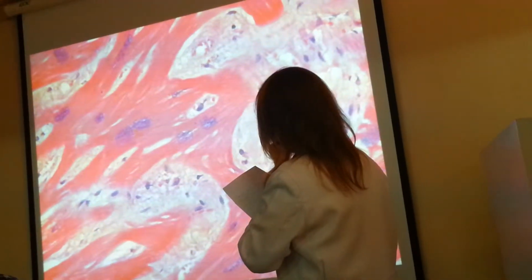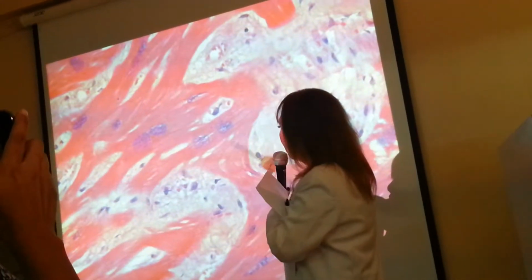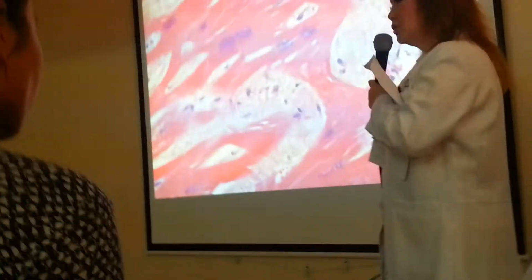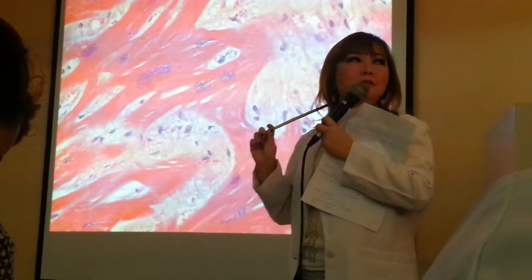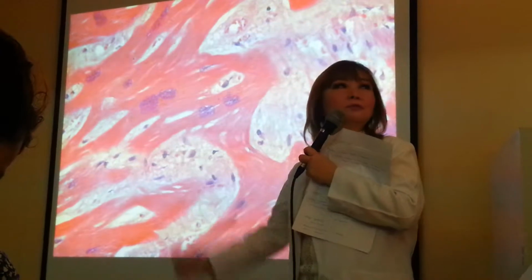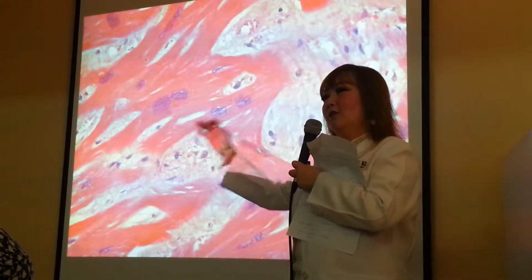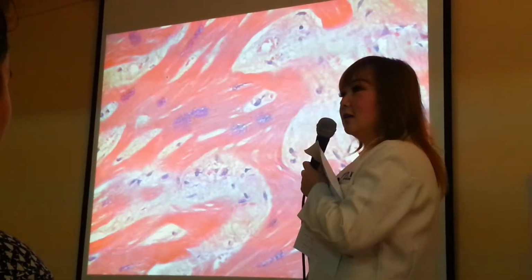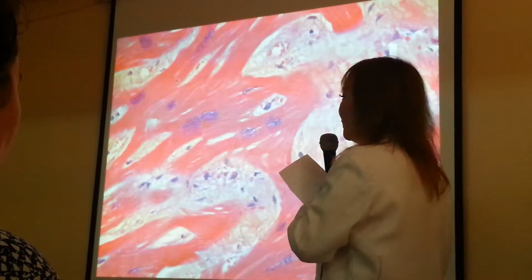Just note the changes that the hypertrophic myocardial cells are more eosinophilic. When I say eosinophilic, it's more pinkish. Homogeneous. How do you say homogeneous in simple terms? Kind of like what? Same color, thickened color, no variations in. Basically homogeneous. You just look it up in the dictionary.